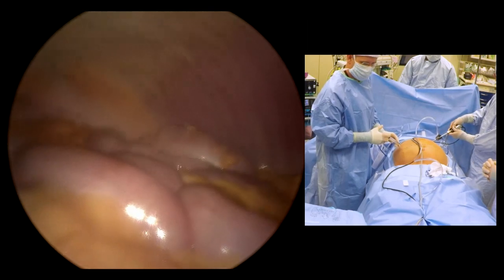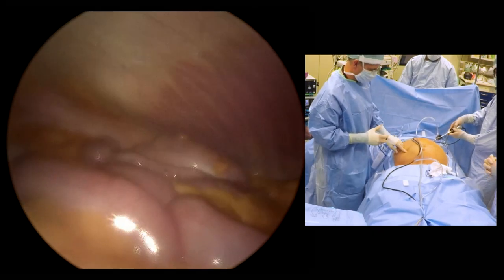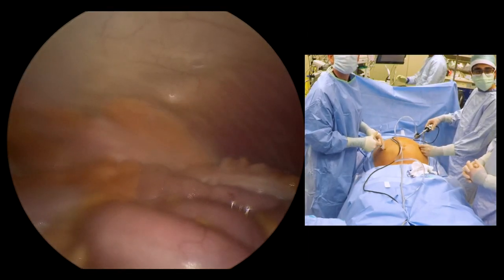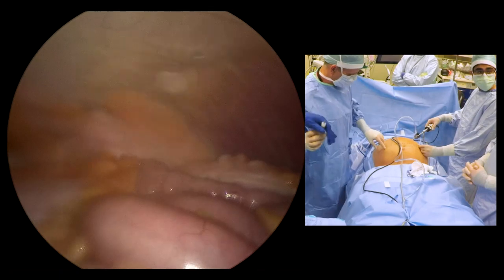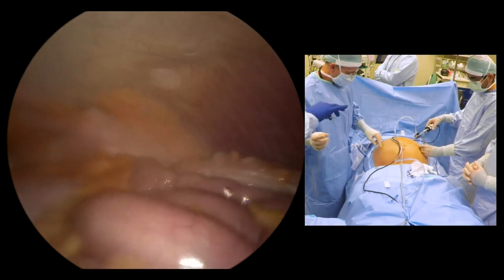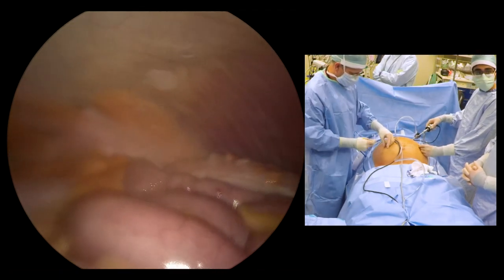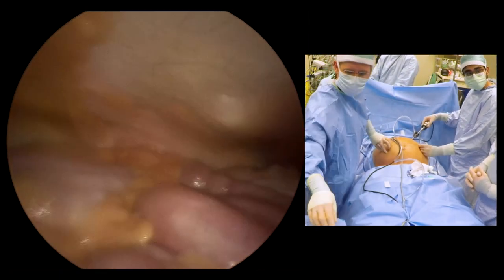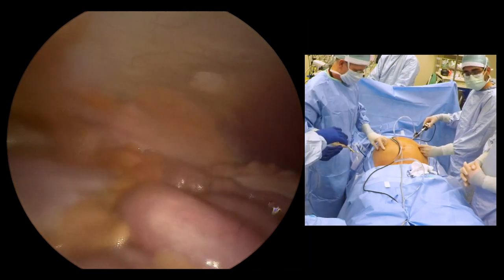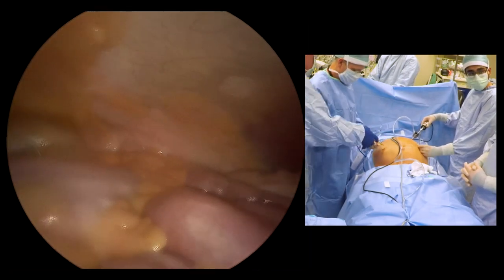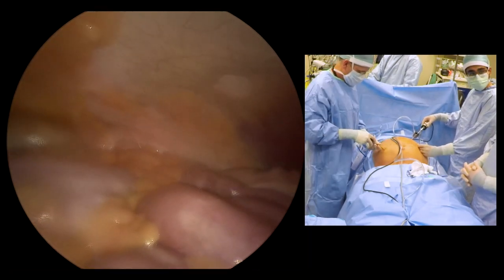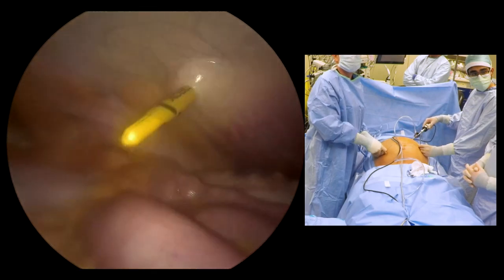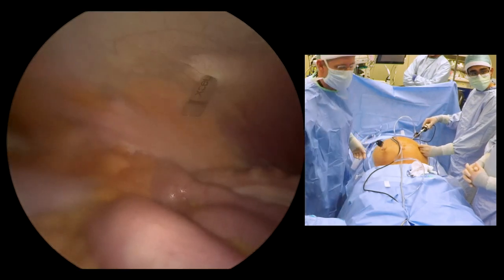With the patient in the Trendelenburg position, local anesthetic is administered so that we can insert another 5 mm port, which will assist with grasping the catheter for proper positioning. Insertion of this port is done under direct visualization to help ensure atraumatic entry into the abdomen.